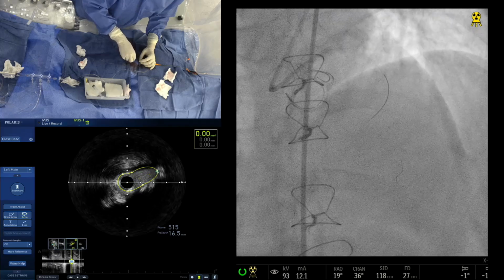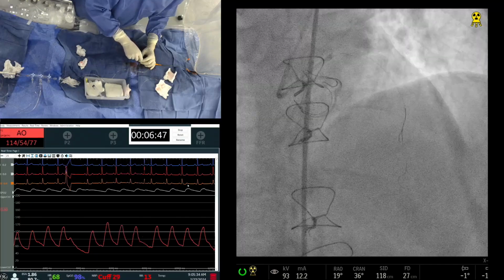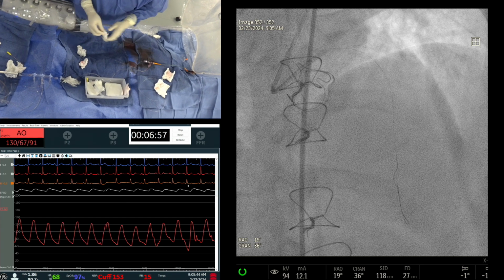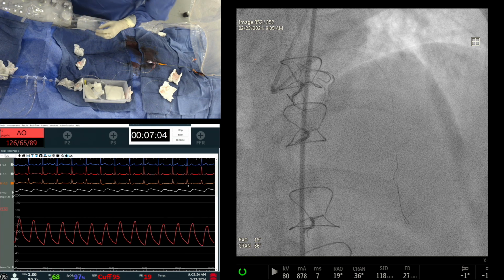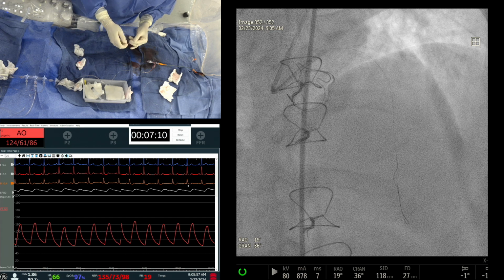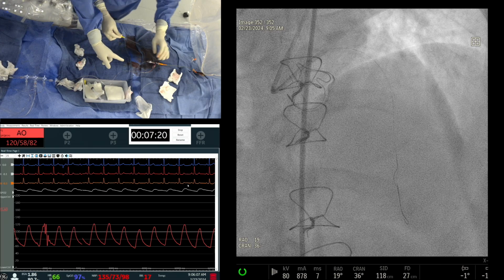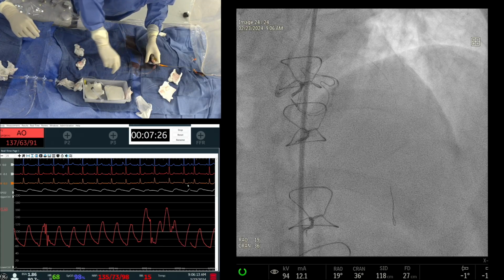After a lot of discussion about the eruptive nodules and calcium nodules, do you think, sometimes when you do nodular treatment like this by Rota, do you keep that in mind? What's the question? Consider what? Actually, nodular calcium and eruptive nodule are two different things, because as far as result is concerned, eruptive nodule has a different kind of outcome. So in a situation like this, do you consider that? Eruptive nodule is most likely in ACS. In this situation, the patient has stable angina, so very unlikely to have eruptive nodules.